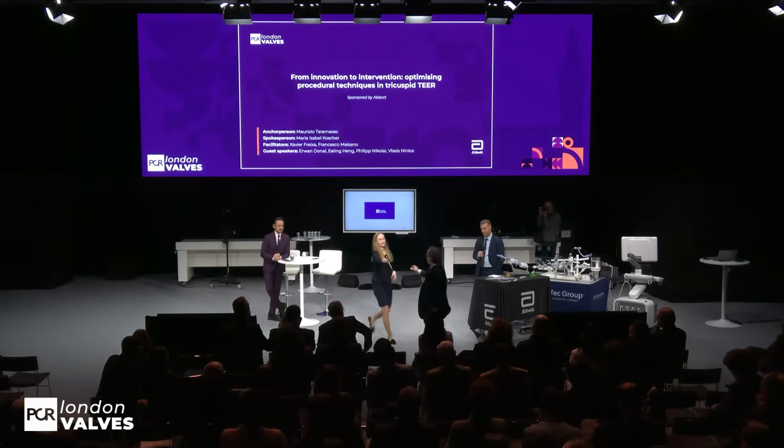Well, it might be, but for repair, I think it's better tolerated in those cases, no? But anyway, I think that if that coaptation gap persists, it's maybe not the best intervention, edge to edge. Maybe more replacement, I don't know. But challenging cases, definitely. Yeah, Aaron, there you go.